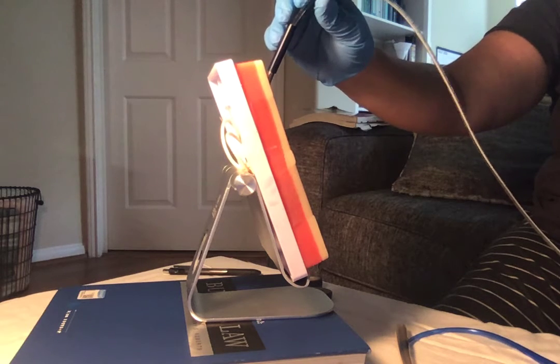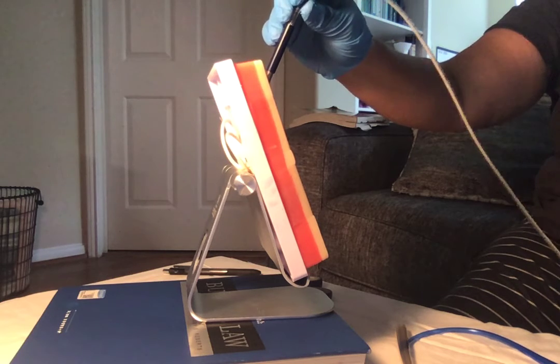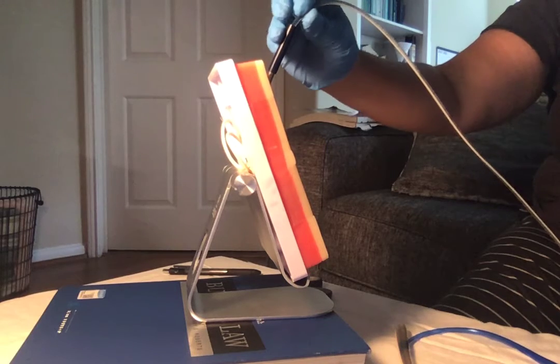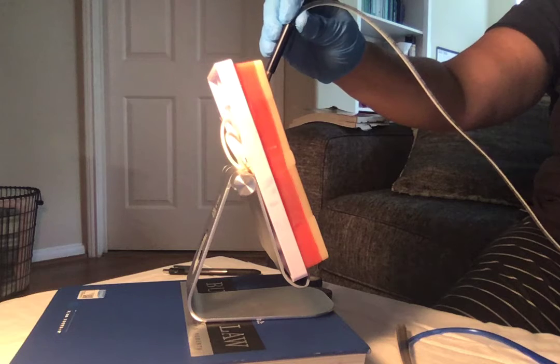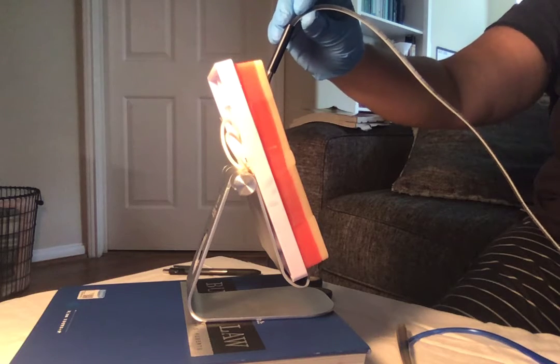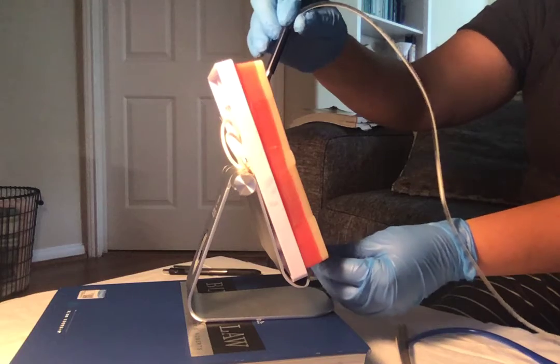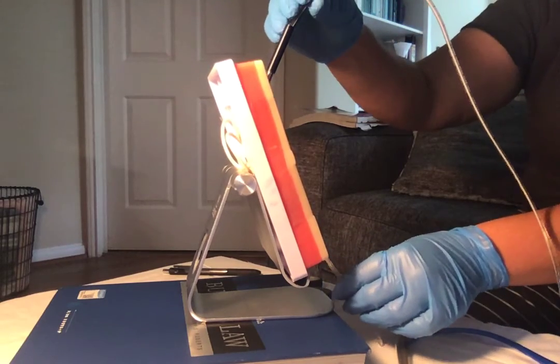Along the way, we're going to check the back of the throat for coiling of the tube with a penlight. So I'm going to ask the client to bend their head forward, chin to chest, and swallow with or without water as allowed, and advance the tube with each swallow. If gagging or coughing occurs, I'm going to withdraw the tubing a little and allow the patient to rest and then continue again to advance. I'm going to advance with swallowing until the marker spot is reached.